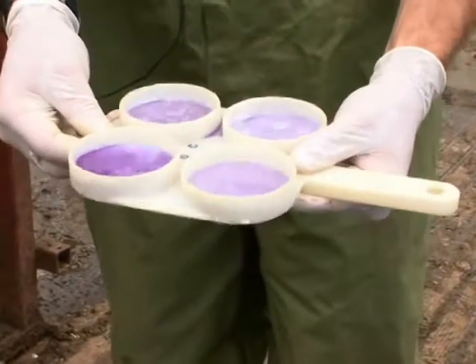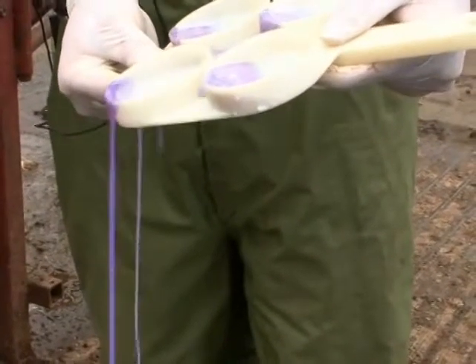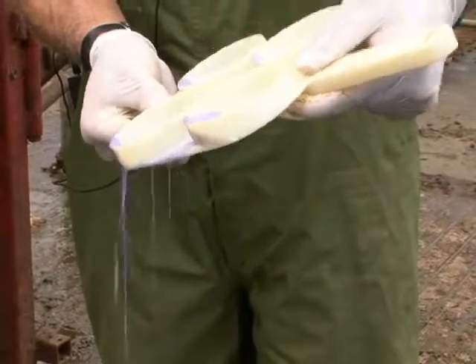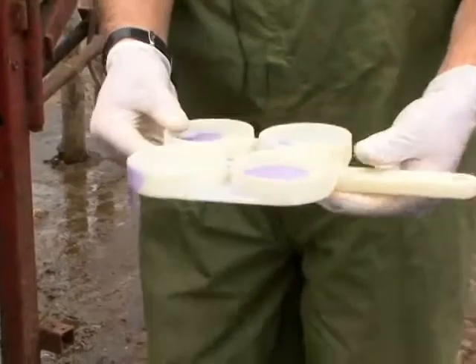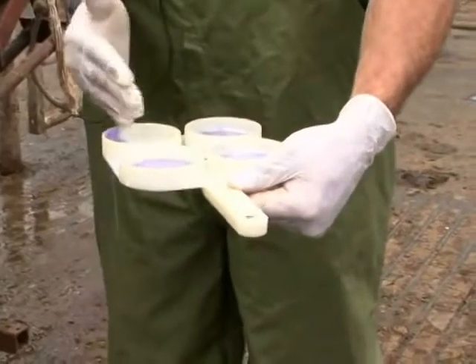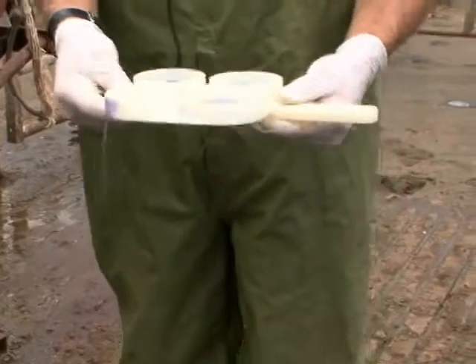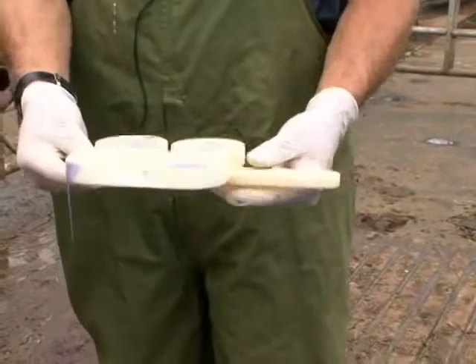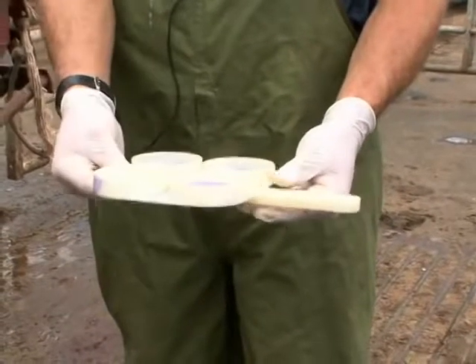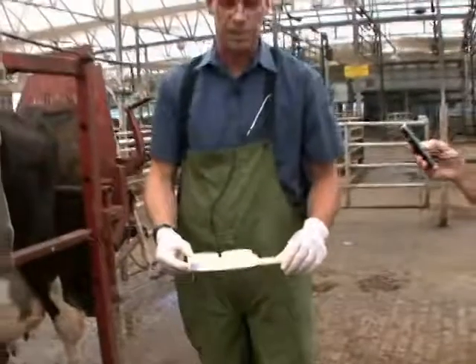To make it even more dramatic, if I tilt it over and allow it to pour out, you'll see it sticks together and comes out in one big giant clump, which indicates a serious infection in that quarter. So in this particular cow, her right hind quarter has subclinical mastitis, and possibly if we strip longer, we may find that she has clinical mastitis. This is a great cow-side test to determine which quarters are high in somatic cell counts and may need treatment.